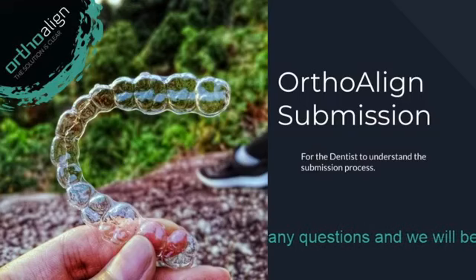These are the four things that you are going to need in order to submit a case for OrthoAlign. So for patient's photos, we definitely want nice high quality pictures in order for our orthodontist to be able to study and see and give an analysis of what our orthodontist can potentially plan for the cases. And then of course the X-ray data that we see here on the bottom left, we want the best quality OPG scans that you can get. We will try not to get the OPG scans that are not clear.